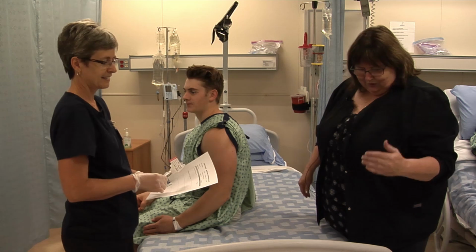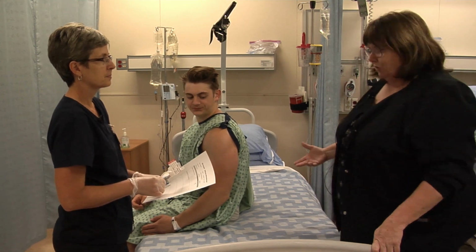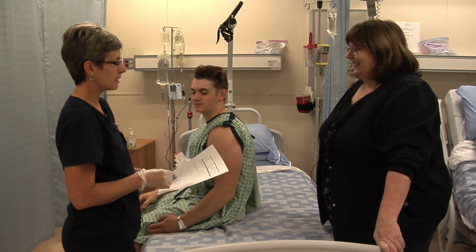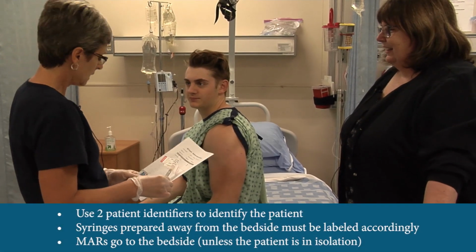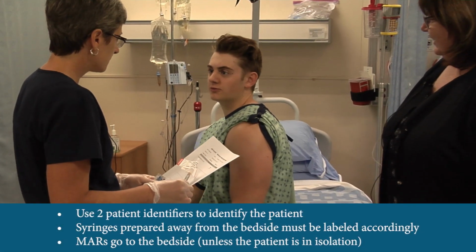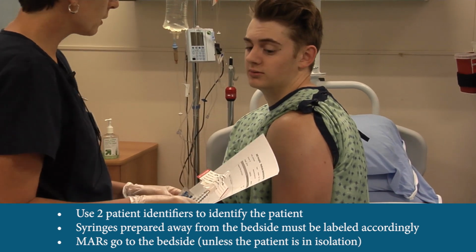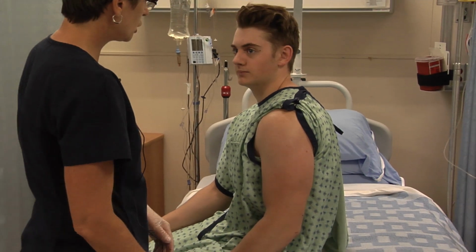Hi Renee, so we're going to be doing landmarking of a deltoid and administering an IM injection using Z-Track. Okay. So I've prepared my medication. I've brought my MAR and my med to the bedside. Sir, can you tell me your name and your birth date? Ross Geller, March 3rd, 1999. Awesome. So I have your morphine for you. It's for pain. You've had it before, right? Do you have any allergies?